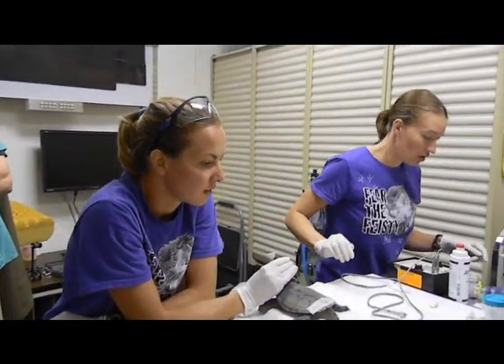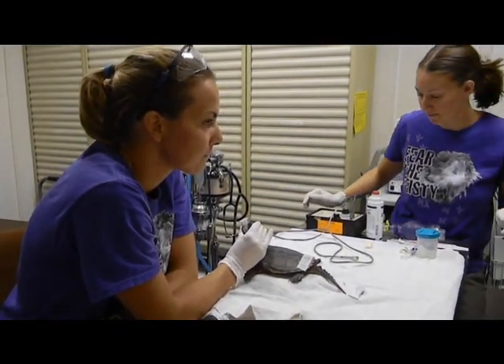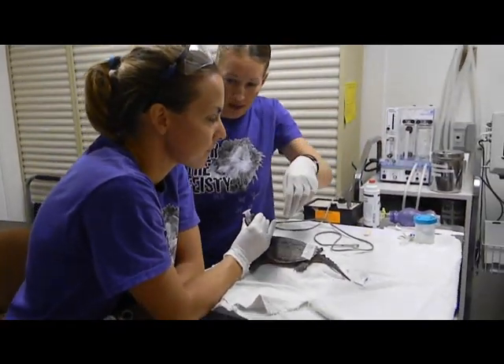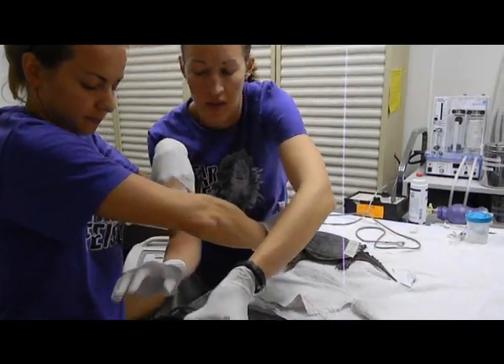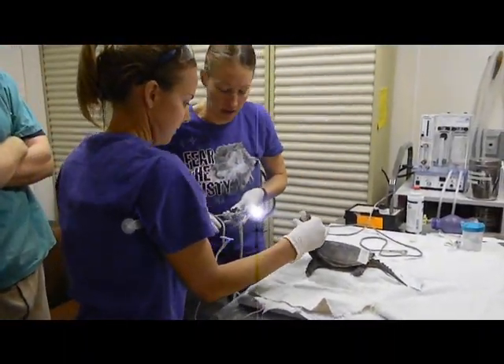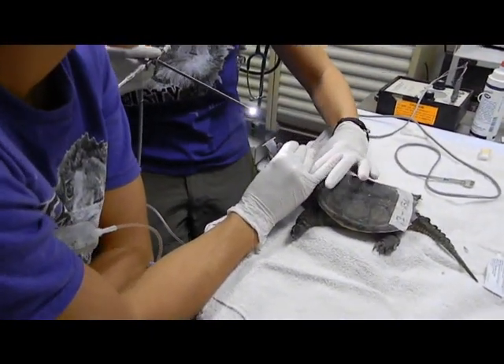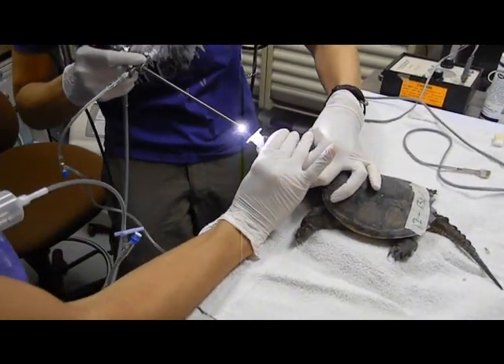So let me just turn off the plate. And I'm going to kind of go underneath you. Okay, you got that over here? Alright, and then I'm going to end up kind of getting in your way.